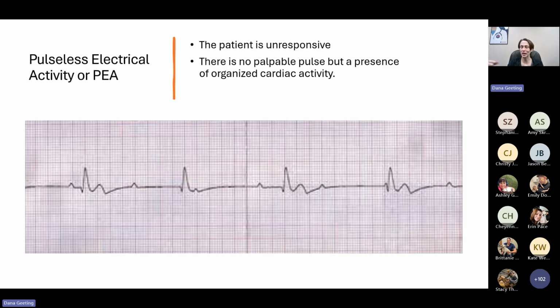But if they're not and they're going into it, then you're going to see a very sudden decrease in their alertness and their exercise intolerance, and you're going to want to get ready to shock them or do the electrical cardioversion. Next, we are going to talk about pulseless electrical activity, or PEA.